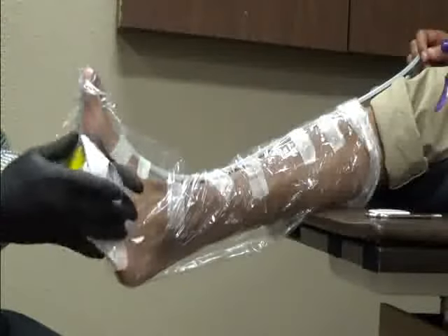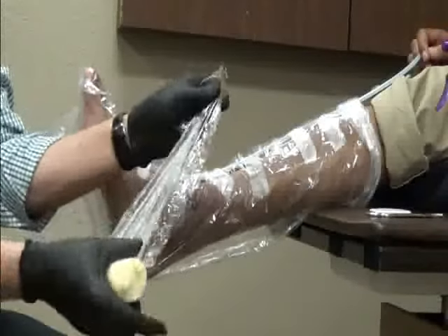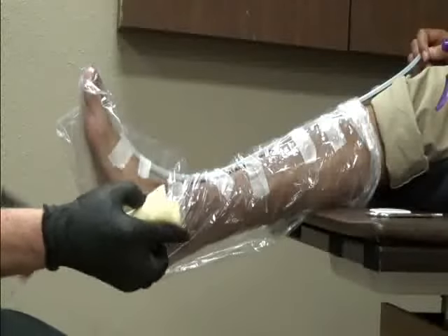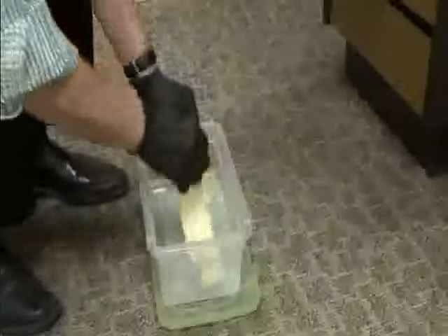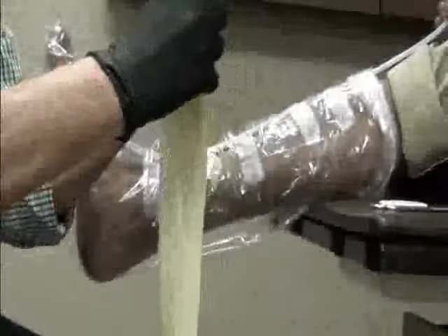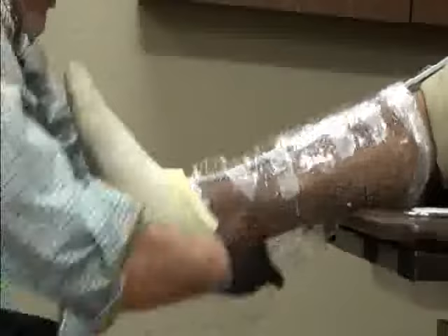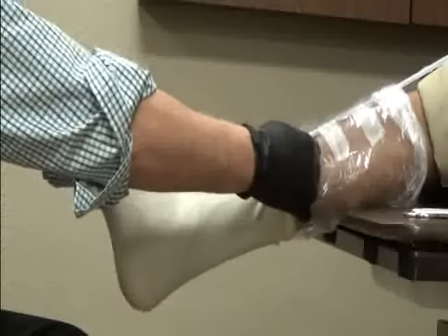It is very important that the next step is performed with latex gloves on. Open the bag of the STS sock and remove the plastic wrapper that's around the fiberglass sock. Unravel the sock completely and soak it in water vigorously. Roll the wet STS material as if it was a stocking. Then apply the sock to the foot and leg, making sure that it's completely unraveled at its proximal end.